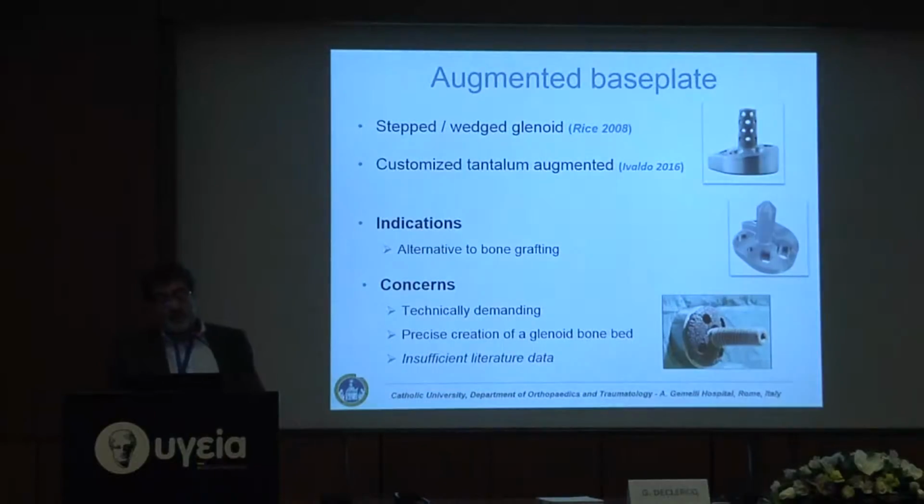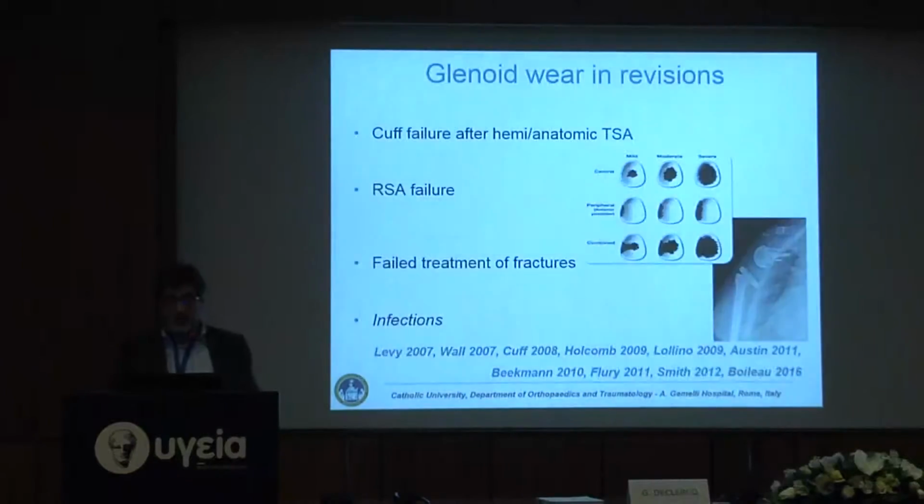And regarding the augmented base plate, the wedged glenoid may be, according to recent biomechanical studies, more stable, or a customized tantalum augment as suggested by Nicky Baldo. The indications are basically an alternative to bone grafting, but some concerns are related to insufficient literature data and to the precise creation of the glenoid bed to accept this kind of wedge, which requires removal of some bone from the glenoid.